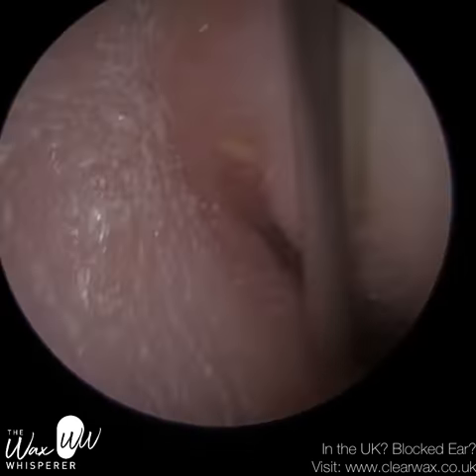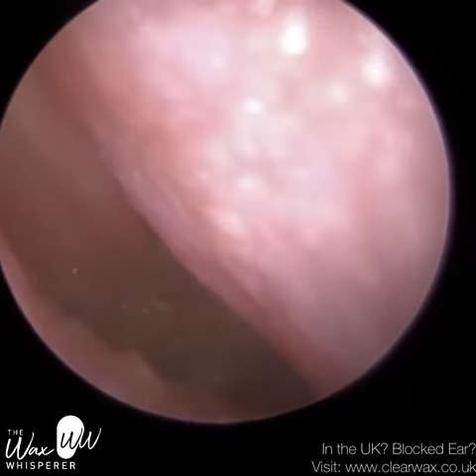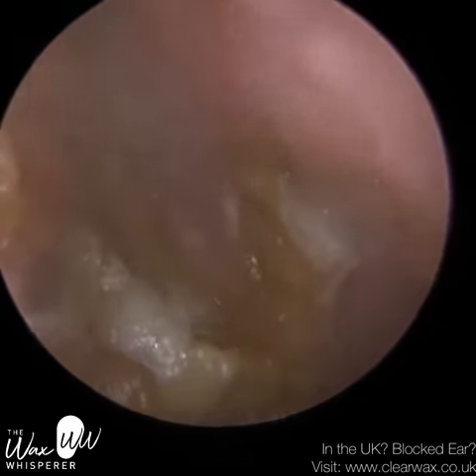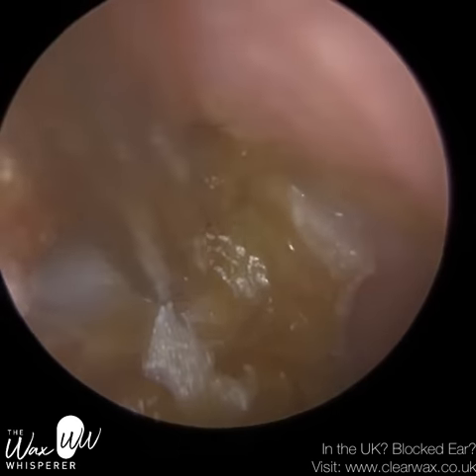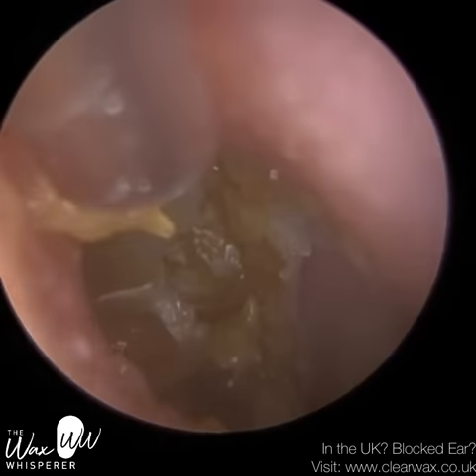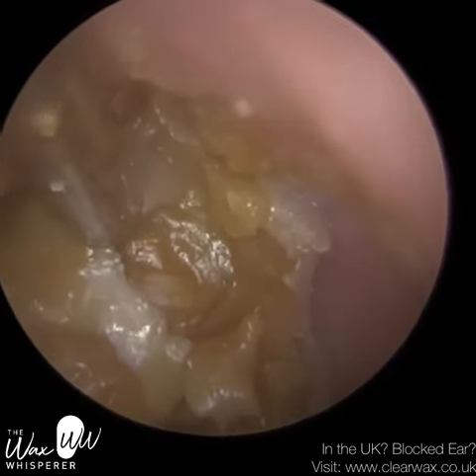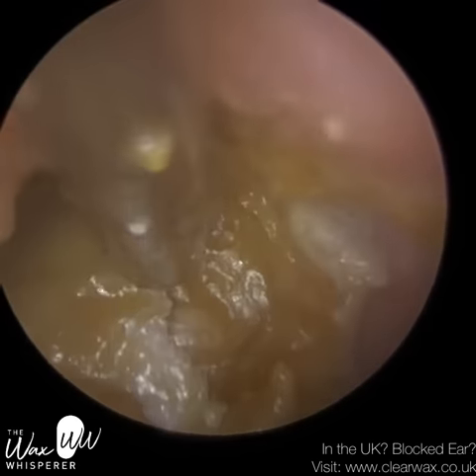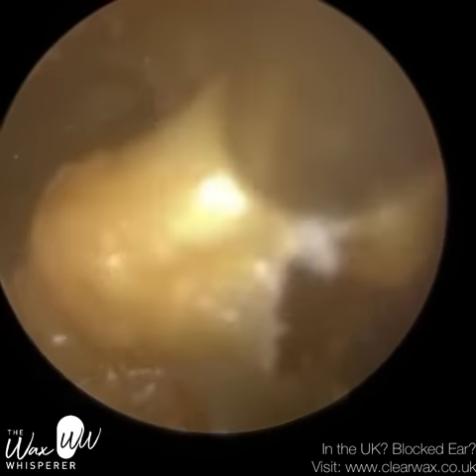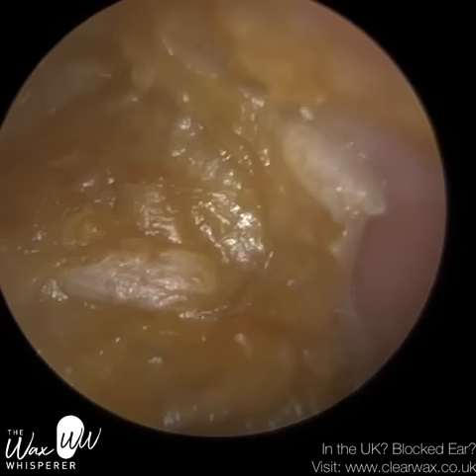The sucker just got blocked there — just coming out of the ear to unblock it. The problem with the fine end is it's prone to getting a lot more blocks, especially with this consistency. We can't use water to flush it — water is one of the main reasons why people develop ear infections, so the last thing we want to do is get water in this patient's ear. And if a patient has a perforation, the last thing you want is water in there. You should never use water to flush out someone's ear when they've got an infection like this.